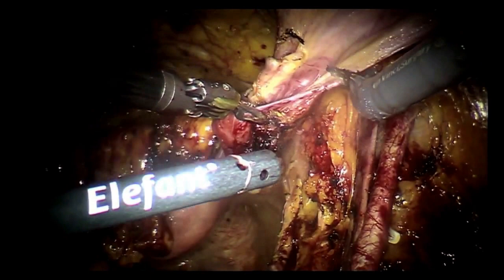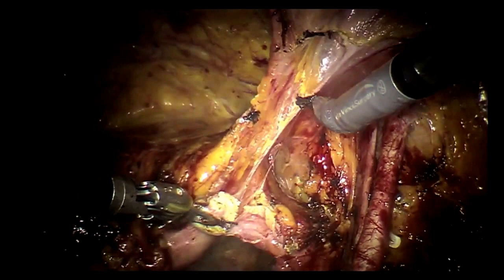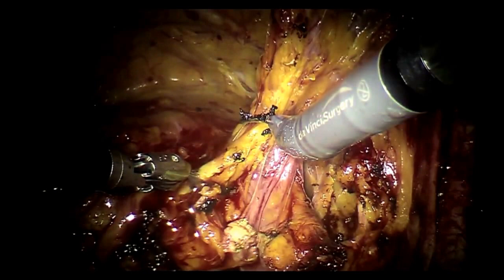Almost ready, yes. Ureter? Okay. Kidney out, okay. So, do you want to get started with the irrigation of the kidney? Yeah, actually, we are ready. So you can get started on that. I'll join you soon. We will scrub with you too. But you can get started in perfusing the kidney and everything.